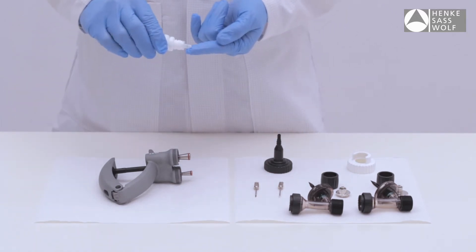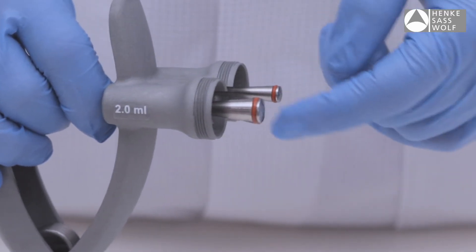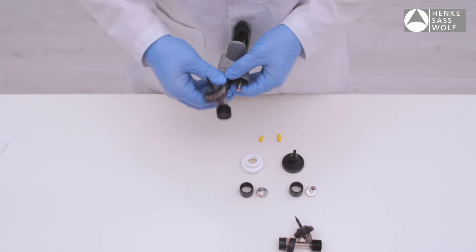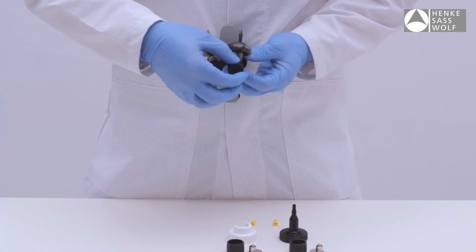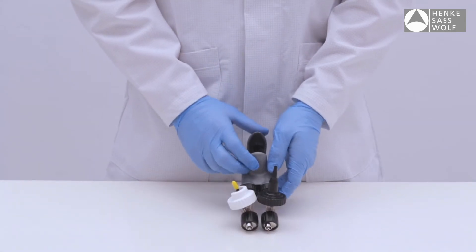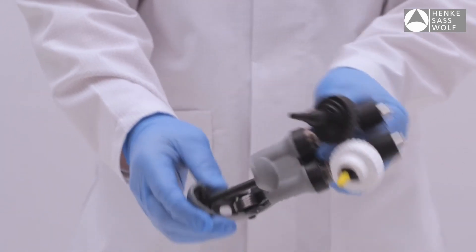Lubricate the O-rings with 100% pure oil, cold squeezed or equivalent vegetable oil. Then reassemble the syringe.